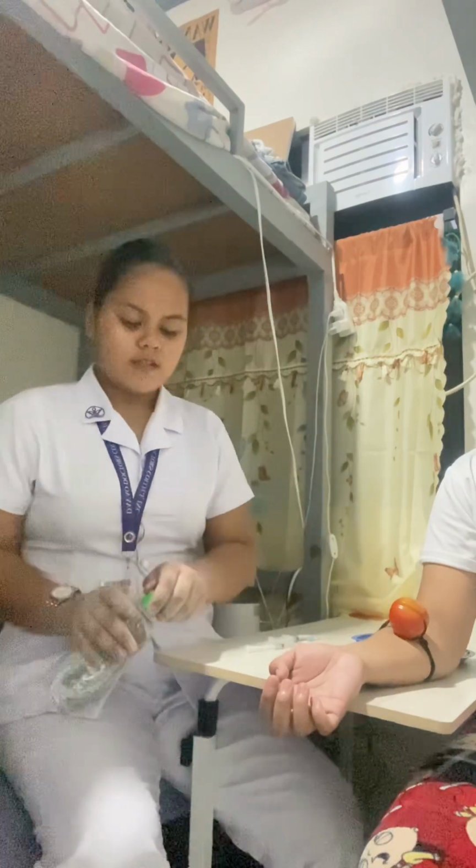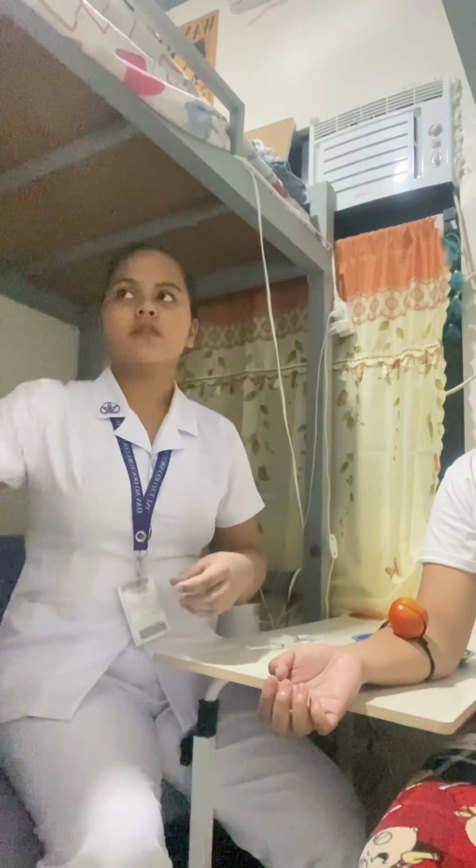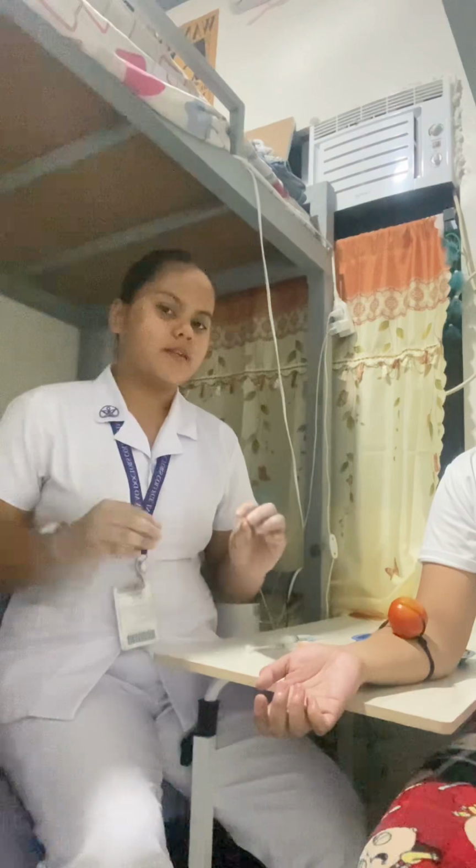Now I'm going to perform a subcutaneous injection. So first I'm going to perform hand hygiene. This is to prevent transmission of microorganisms. And then after that, I'm going to provide the client privacy by closing all the doors and drawing the curtains, which I have already done prior to the procedure. And then I'm going to introduce myself to the client, because it helps to establish rapport and make the client feel comfortable. And then after that, I'll be verifying the client's identity.